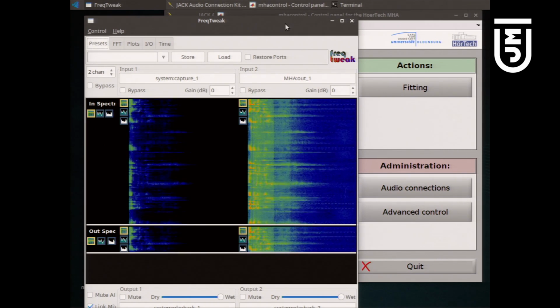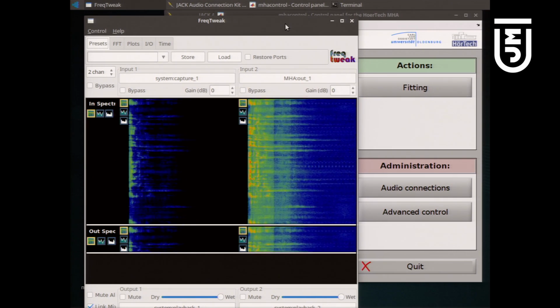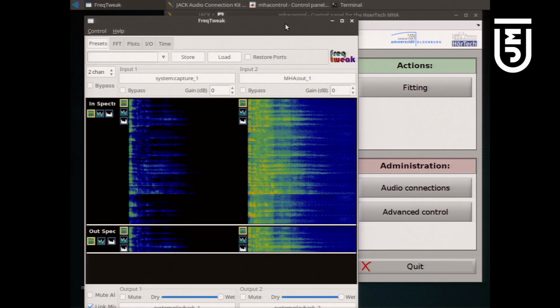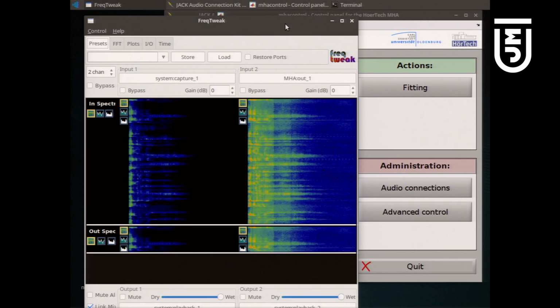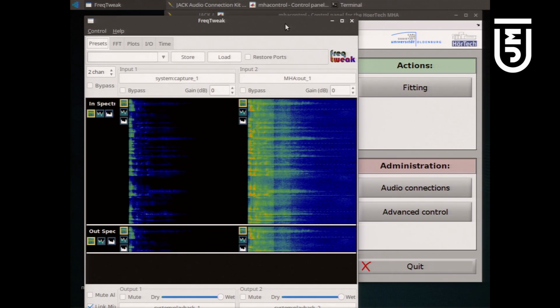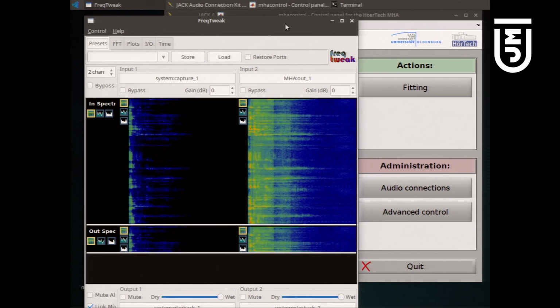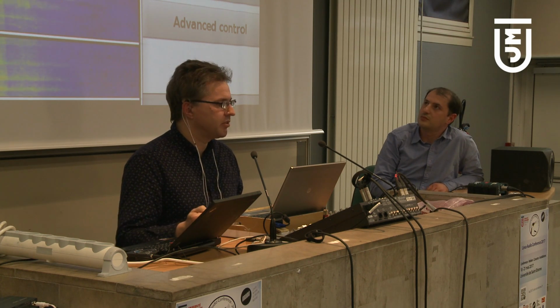And you might be wondering why I'm wearing the hearing aids, which are now fitted for a hard of hearing person. Well, I think a researcher should do something like this, because you're basically safe if your hearing aid works as you intended. Because, as I said, the uncomfortable levels for hard of hearing people are often not elevated if you compare them to normal hearing people. So I am relatively protected from too loud sounds, even if I wear a hearing aid.